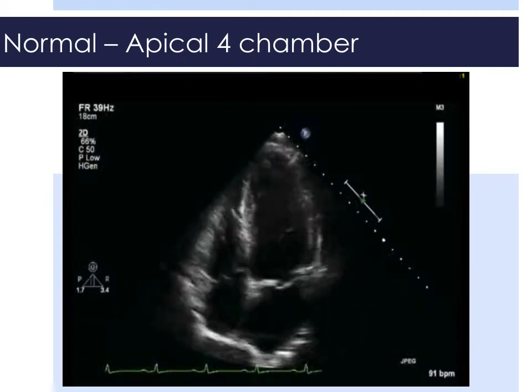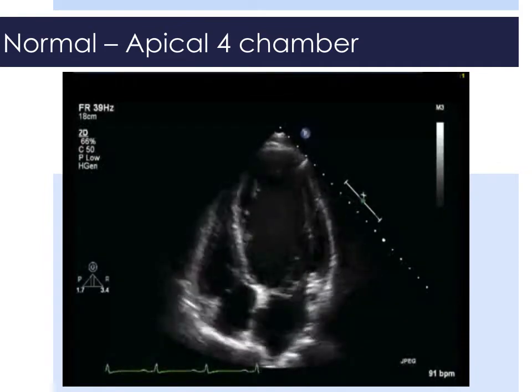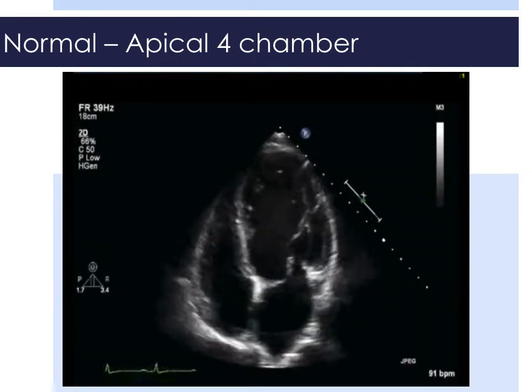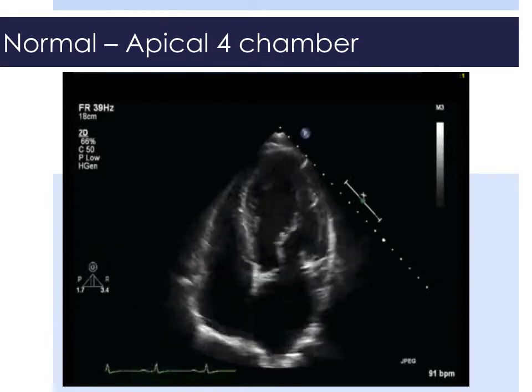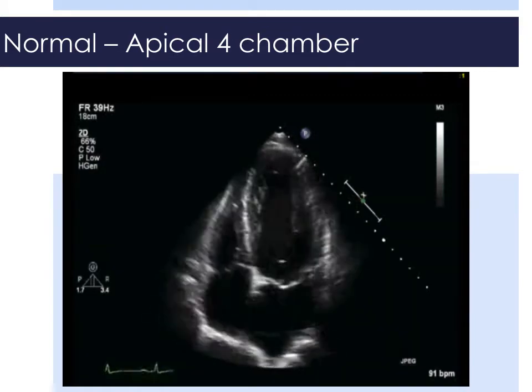We should also appreciate the basal part of the left ventricle moving towards the apex, and the apex contracting as well and changing its dimension between systole and diastole. It's our overall judgment of the left ventricle, and we should clearly see a difference between systole and diastole.